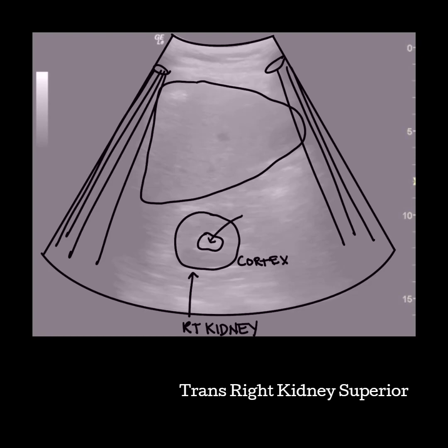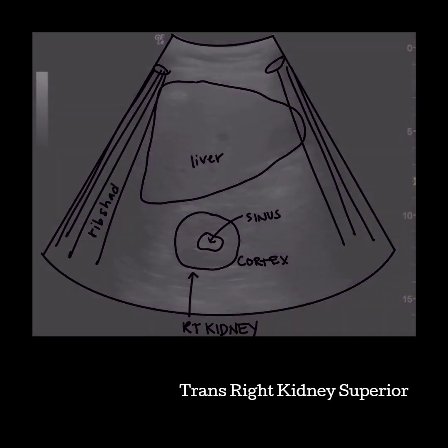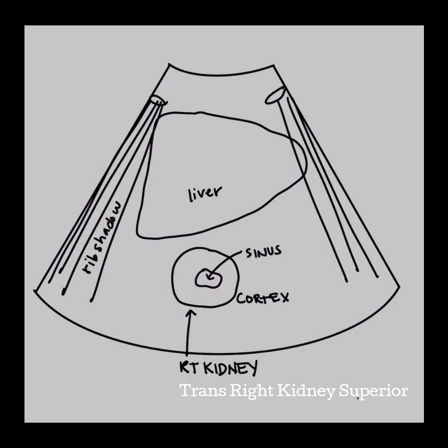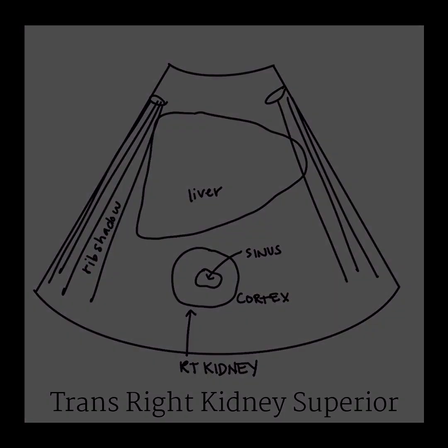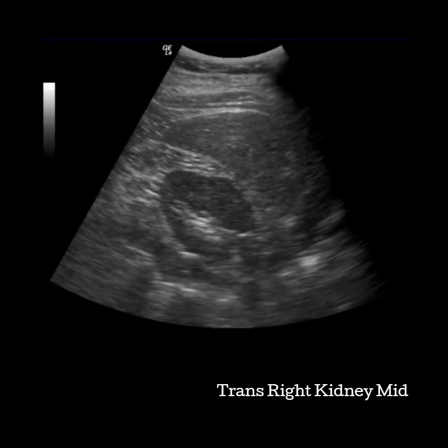Keep moving inferior on the patient. Watch for the sinus to come in and then the hilum to appear. When the hilum is present and you have even cortex all the way around, this is the mid transverse kidney.